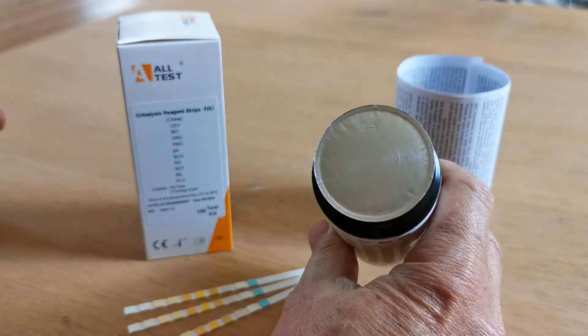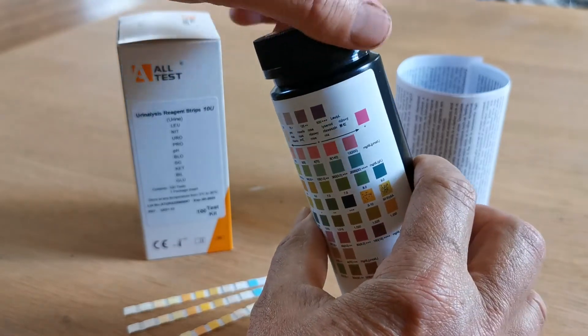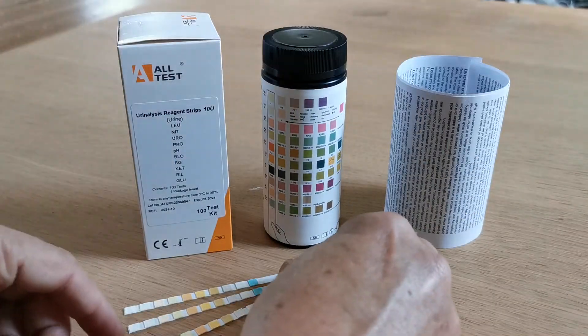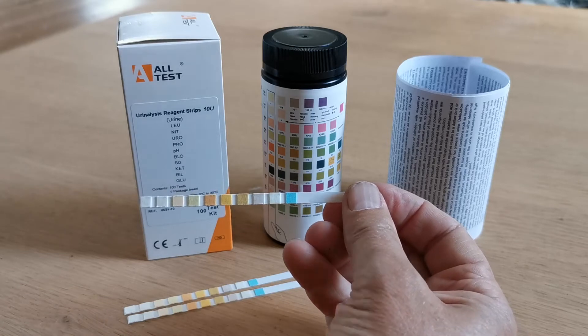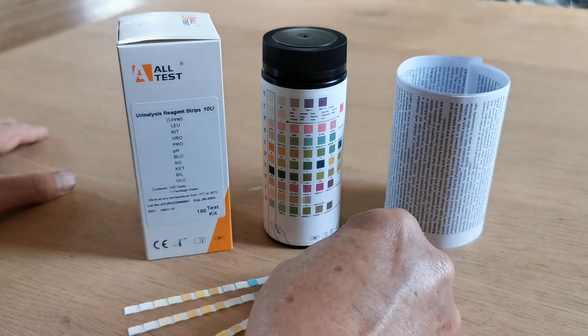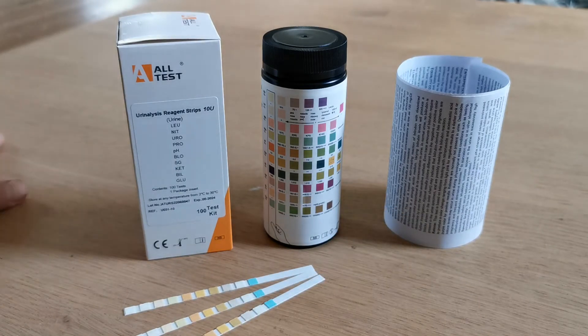When it is presented to you initially, there will be a foil seal which ensures the strips are kept dry. Inside there you will have 100 of these 10 parameter, 10 pad urine testing strips, and a desiccant pouch which keeps them dry. It's essential, when the seal is broken, to make sure that the desiccant is remaining in the vial and that the lid is placed back on the vial after each test strip is removed.